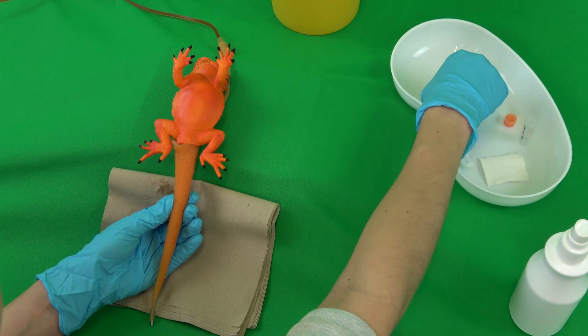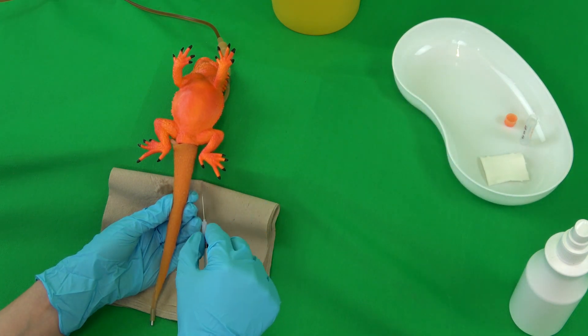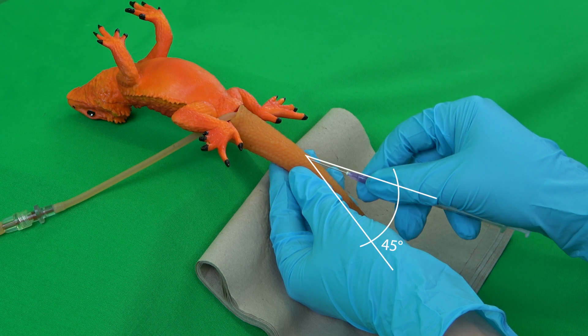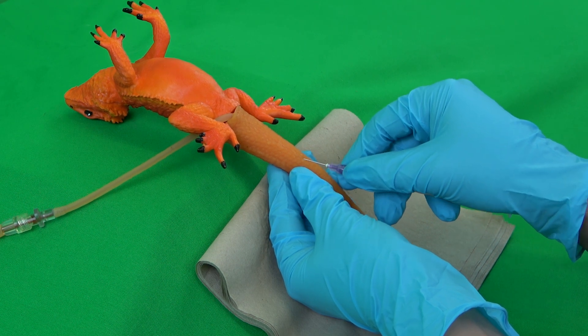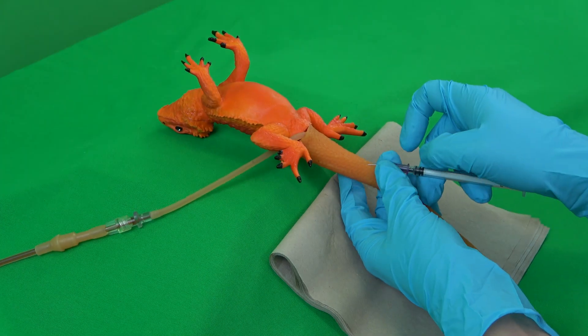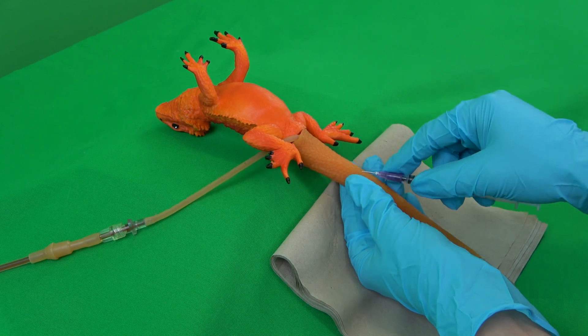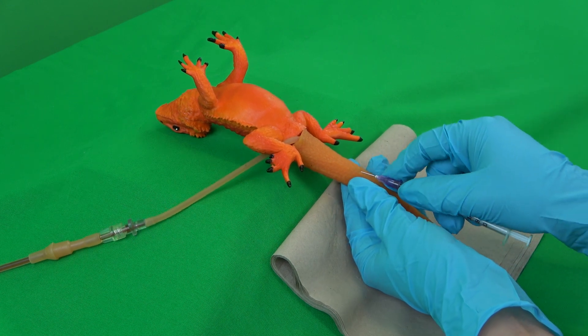The prepared syringe and cannula can now be taken into the dominant hand and fixated on the hub to puncture the vein at an angle of 45 degrees. The bevel should point away from the patient. If at first no blood can be seen inside the cannula hub, the angle can be slightly altered, without however removing the cannula from the animal entirely.